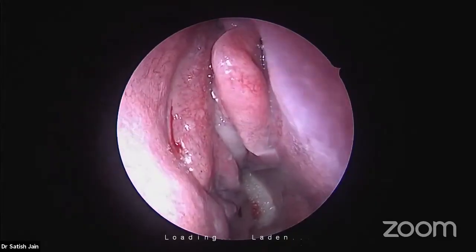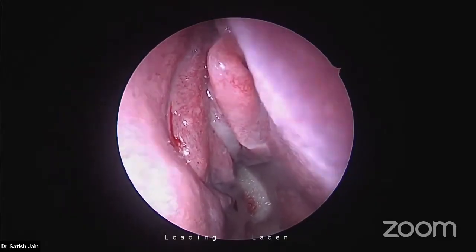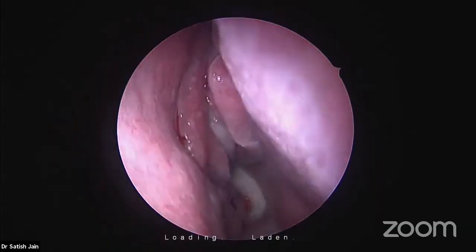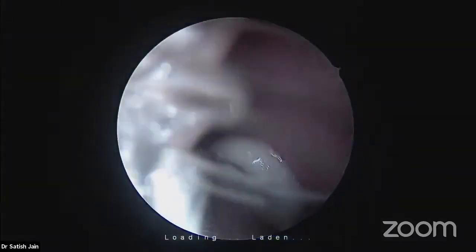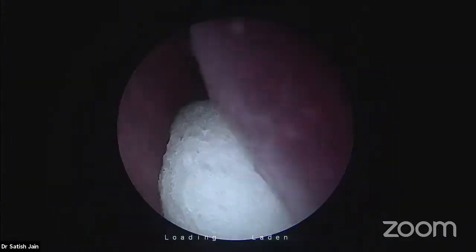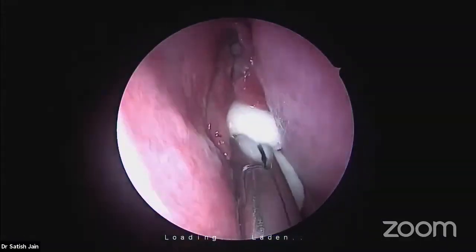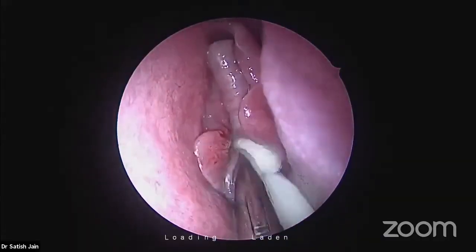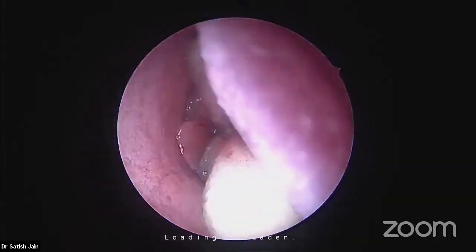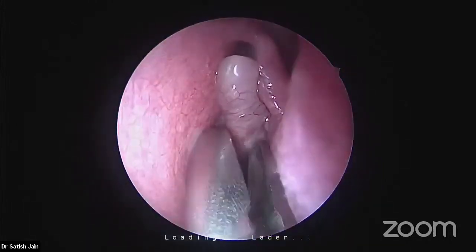Infiltration has its own adverse effects. They have been proven, published. Infiltration going into the internal carotid artery circulation, the anterior ethmoid circulation, going to the ophthalmic artery, leading to blindness. Infiltration going into the systemic circulation, leading to arrhythmia, cardiac arrest, has been reported. So why take such a chance in such a benign disease unnecessarily?